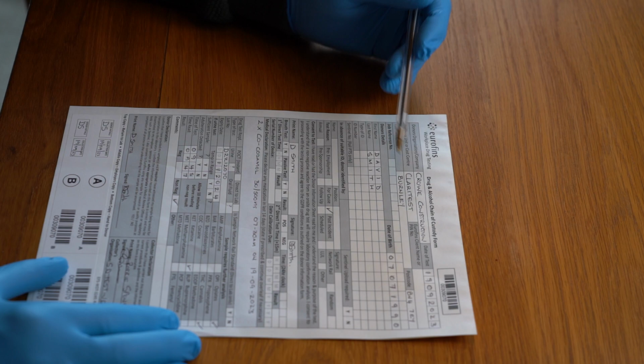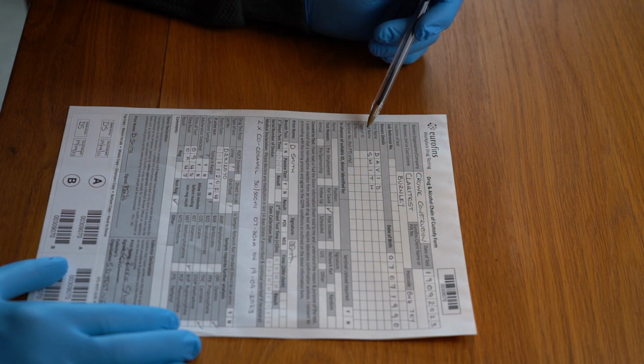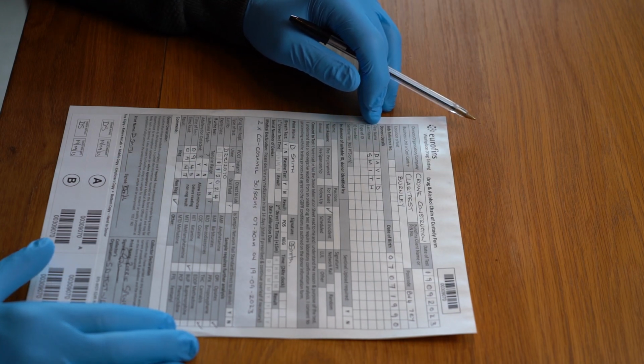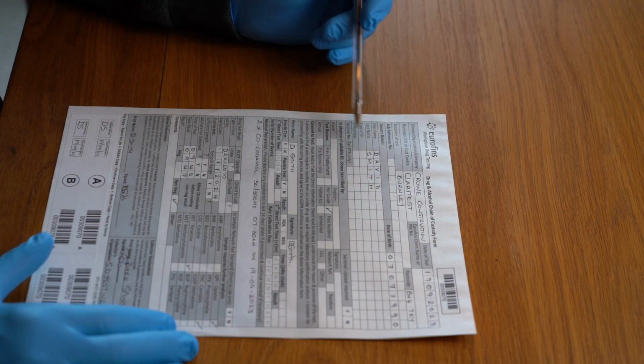The donor details, date of birth 07/07/1990, first name David, last name Smith. You don't need to fill in any of the other details here about identifying the donor. Hopefully you'll know that the person sitting in front of you is the person you're supposed to be testing, and so you don't need anybody to identify that person.